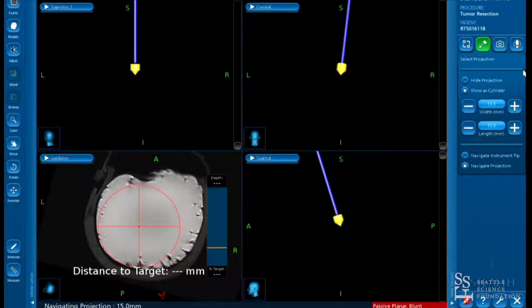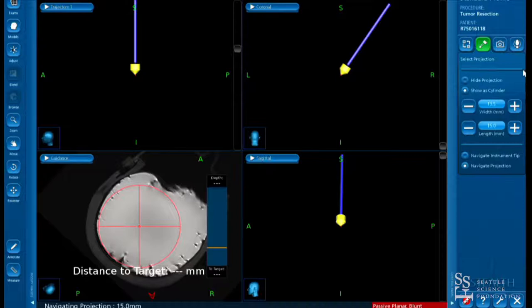We have a fake target set up — there's not a real lesion here. For patient positioning, if you're using a microscope, it's the same as any open case: the trajectory you're taking, the long axis of your approach, is approximated by a line from your eyes to your hands, and your scope is sitting there as you look line of sight.